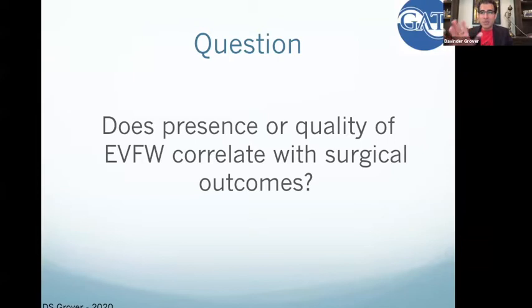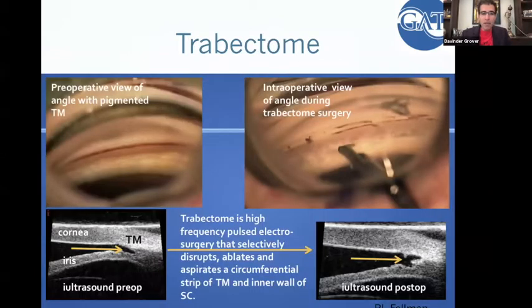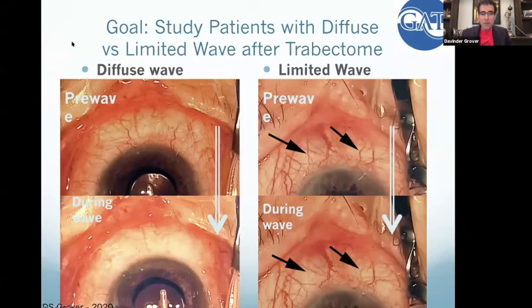So we asked ourselves, what does this quality or the presence of a wave mean anything? Does it correlate with outcomes? And so we looked back at our trabectome data, because this was a long time ago before a lot of this MIGS stuff came about. And as you know, trabectome is kind of an electrocautery of the outflow system of the trabecular meshwork. And we wanted to know whether these two patients behaved differently.